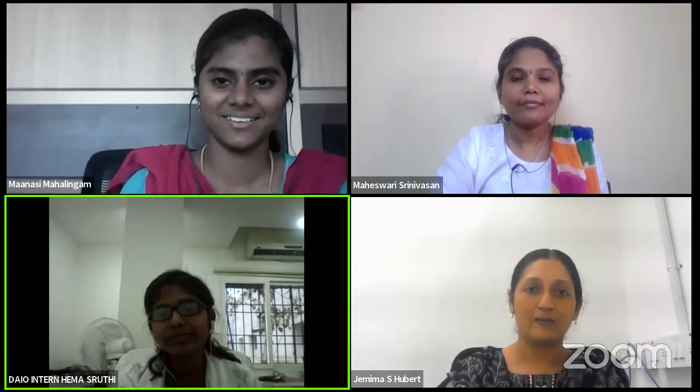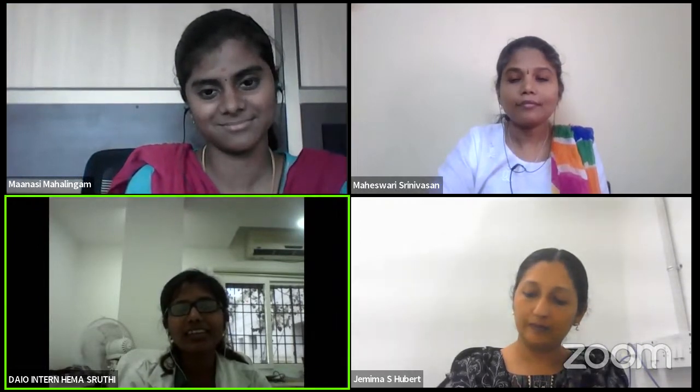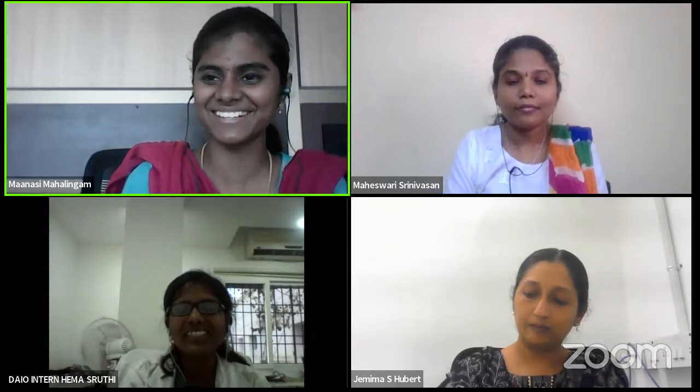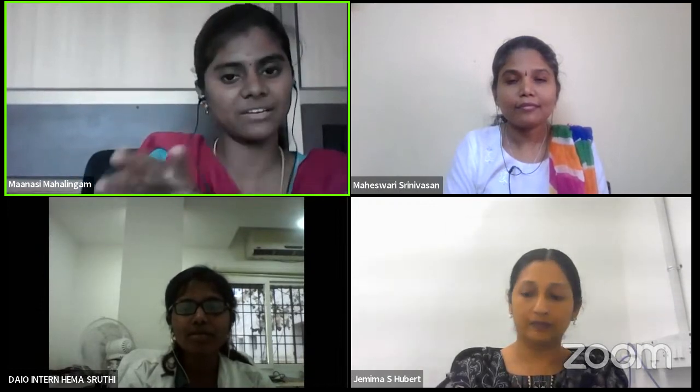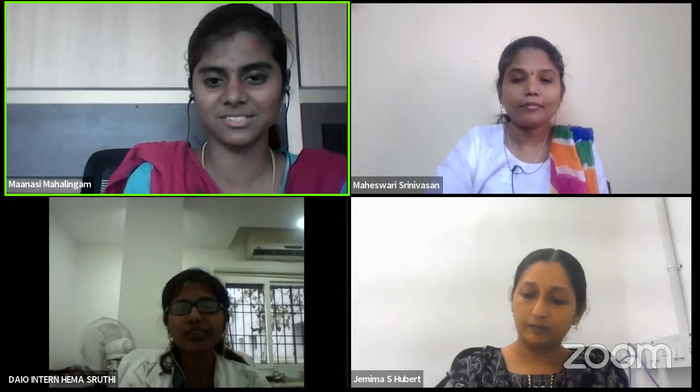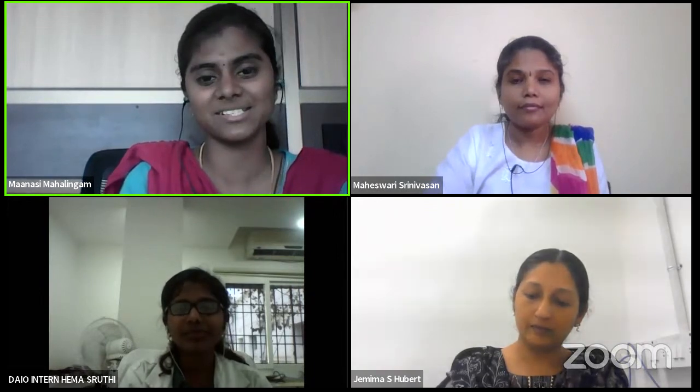ARMD. So, ARMD has altered foveal contour. Is it so? Don't get scared. Get relaxed and then answer. So the foveal contour should be like a dip. When it will be elevated, or when it will not be, there won't be any dip. I'm asking those conditions. Any one or two conditions. You had those in your presentation.